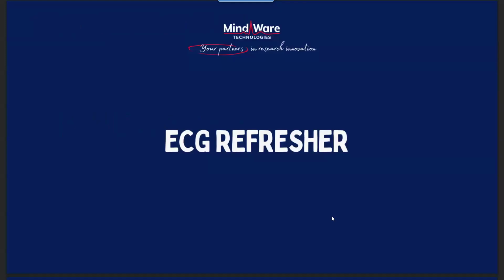So now that we've had time for people to trickle in and we've gotten through some of those announcements and reminders, I'm going to transition us into the actual content of today for the webinar. Since we are going to be talking about ECG, PPG, and pulse transit time, we are first going to start with a refresher on ECG, since this really will be the timing anchor that we will ground our PPG and pulse transit time analyses with.